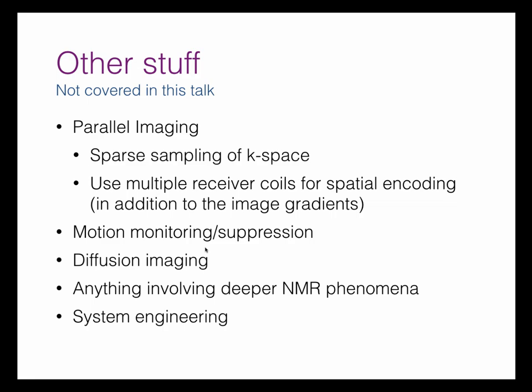And when you read out in a certain direction, you can restrict the field of view there because you can apply filters on your readout train. So even if you want a certain slice, you can play games with how you acquire it within the slice in order to restrict the field of view, and that may help with speeding up the acquisition.